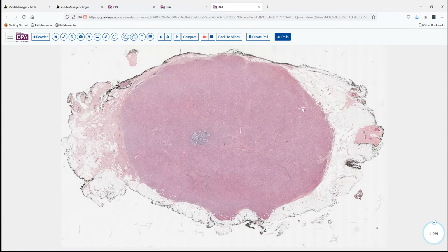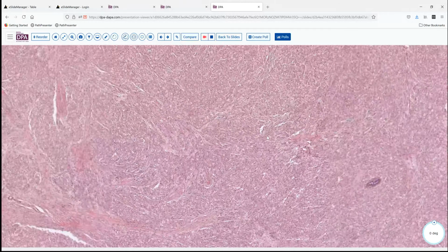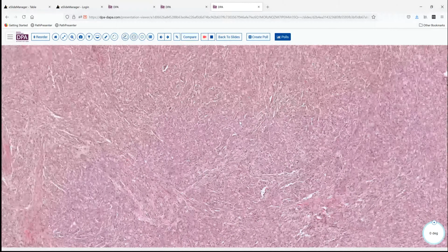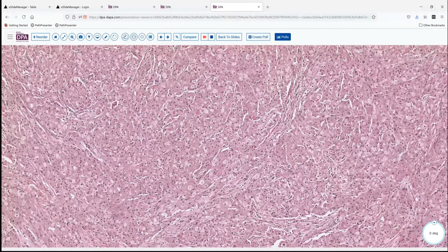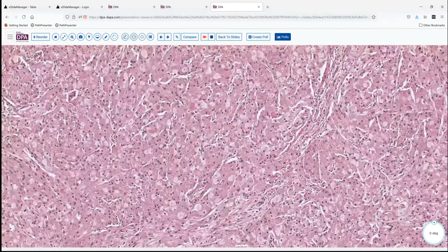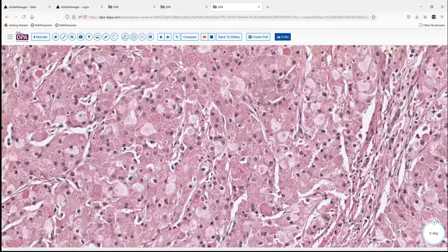Elsewhere in the soft tissue, it can arise in subcutaneous tissue like this lesion. Again, I show you this lesion primarily to show that not all of the cells are uniformly granular. This has a fair population of these slightly cleared out cells with paler eosinophilic cytoplasm. These are still part of the tumor. They're just less granular than these other cells. And here we see one that's very hypergranular. So the granularity in any given cell can be variable.